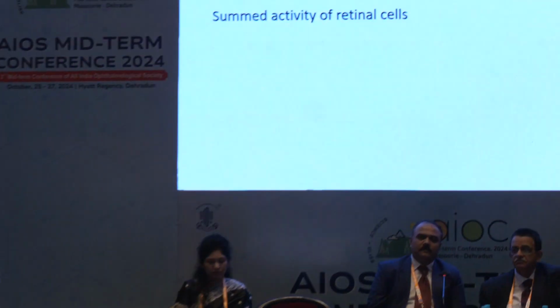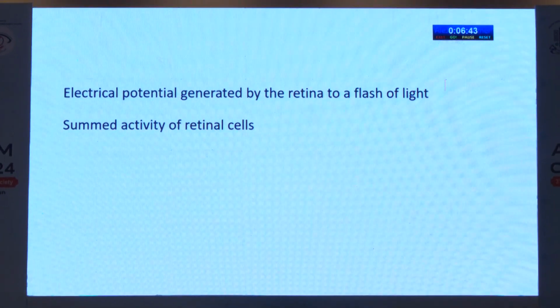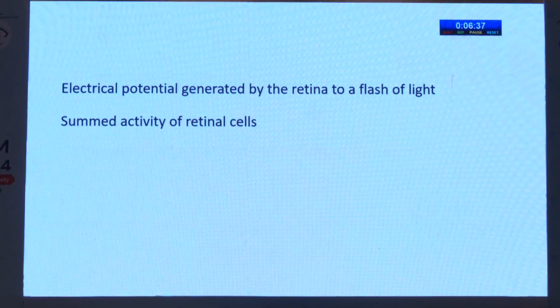Good afternoon all. So my topic is ERG and EOG for the general ophthalmologist. The electroretinogram measures the stimulation of the retina when light falls upon it. It is just the sum total of the various electrical activity occurring in the retinal cells.